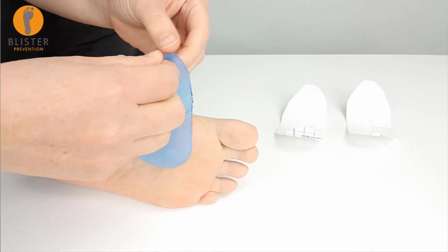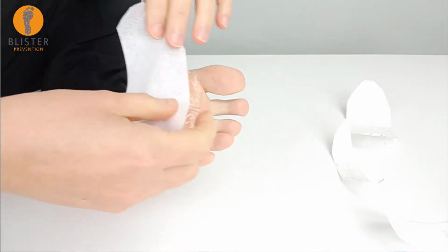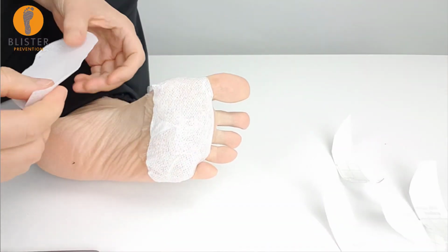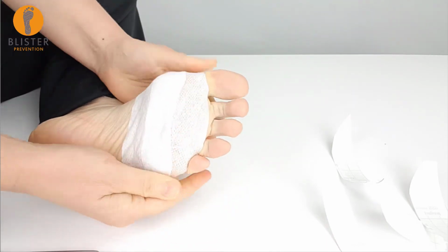You don't just lay this on your skin and leave it there. You have to put tape over it so it stays in place. So it's bound to your skin and insulated by the tape. And this ensures any cooling effect is very short-lived.